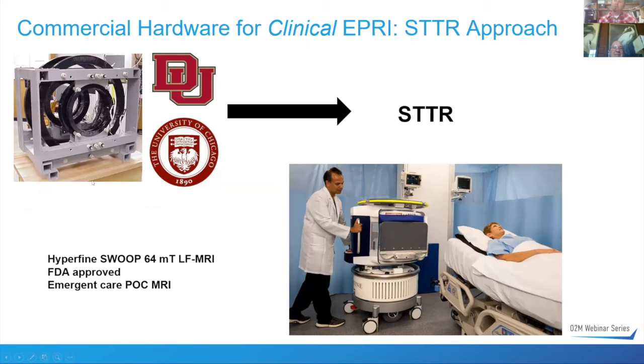And so this is a picture of the DU 250 megahertz magnet that I spent many hours on during graduate school. There's a sister system, which is larger, and I would call a small human imager in Chicago. But this kind of design exists. You could look at pulling out like that.